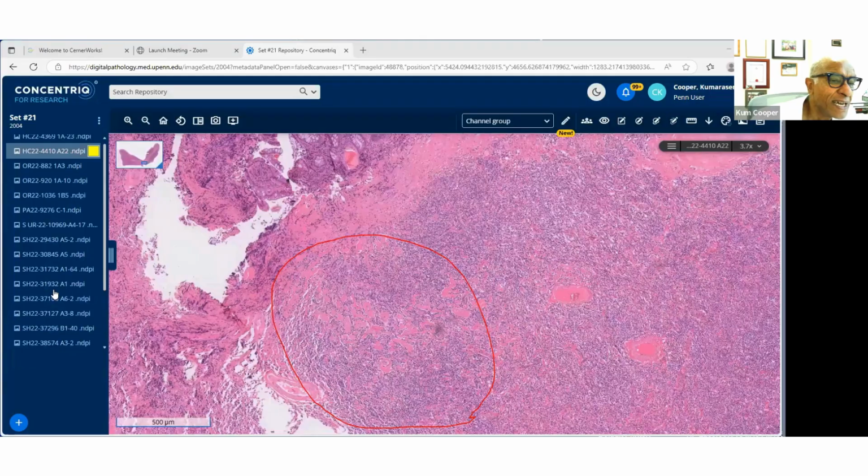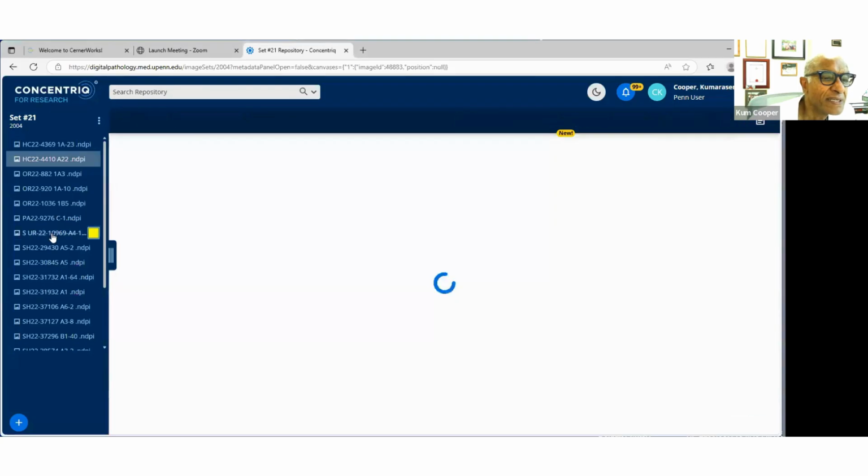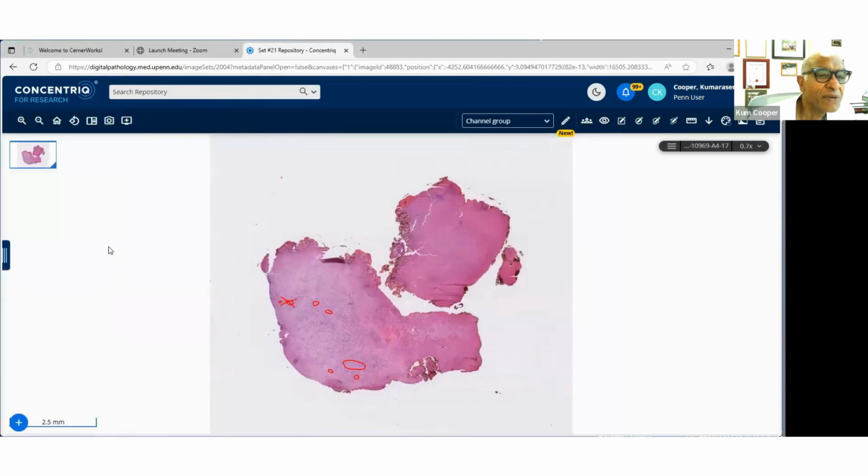This is a case, if I can find it. Oh, there it is here. Okay. Thank you. Okay, what do you think of this one? This is an interesting case. Fascinating. I still find it fascinating, and I think of it every now and again. It's a wonderful story, and I'll share the story with you. Let's see what you think first, okay?